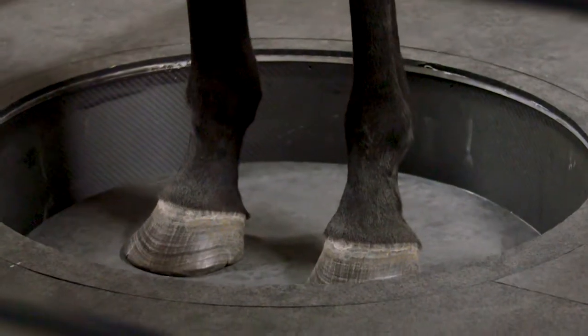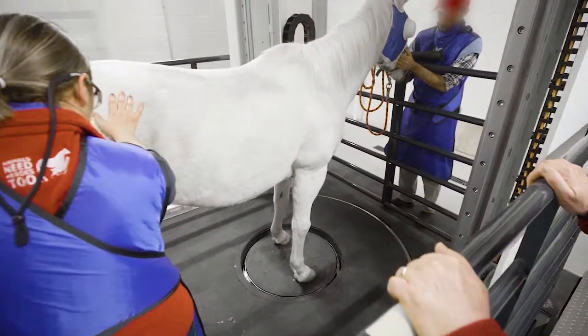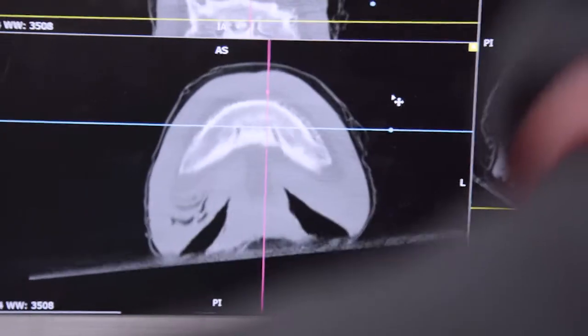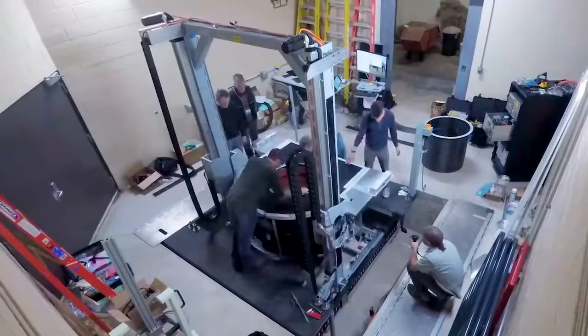The first day was very exciting. We scanned six horses of various breeds and sizes. Of those horses, two of them showed that there was pathology in their legs that wasn't identified on radiographs. The installation and assembly was completed mostly on the first day, and by the second day the unit was up and running.